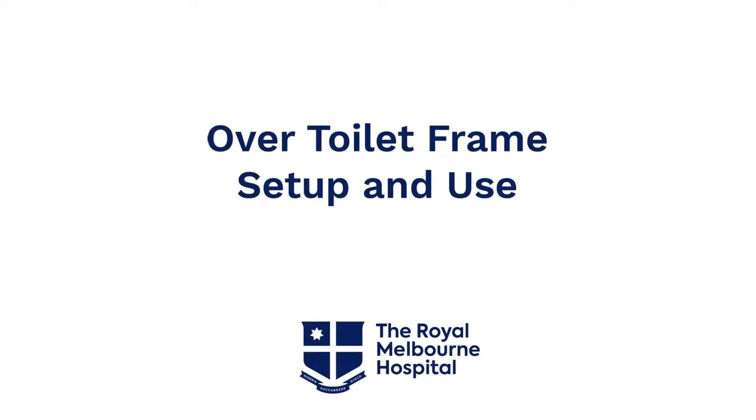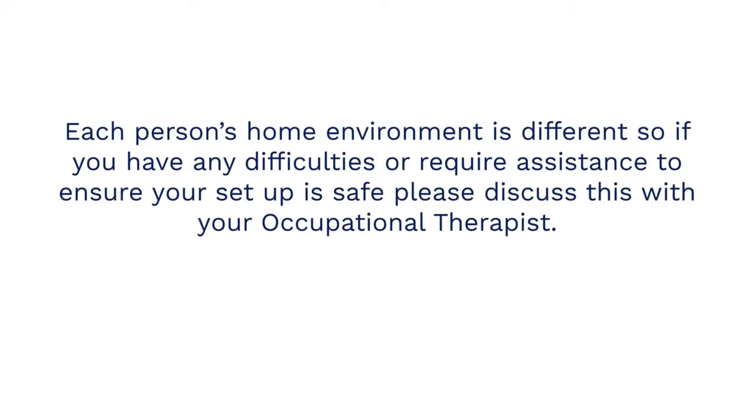Over toilet frame setup and use. The Royal Melbourne Hospital. Each person's home environment is different, so if you have any difficulties or require assistance to ensure your setup is safe, please discuss this with your occupational therapist.